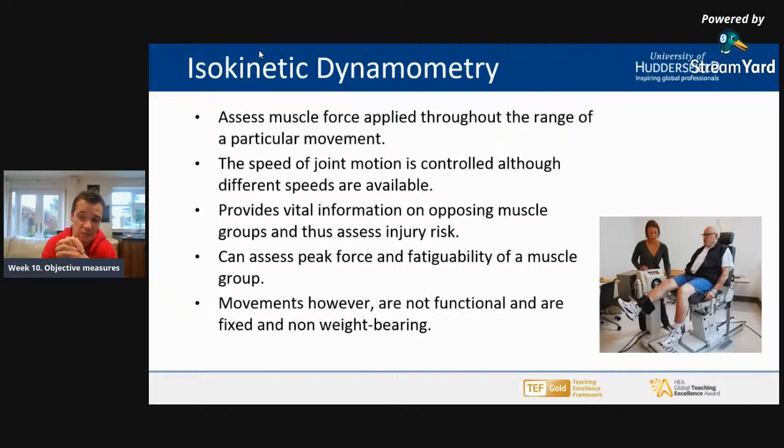that we're set up for knee extension and flexion. So what the isokinetic dynamometer is assessing there is the strength of the quadriceps against the hamstrings. And if you go on to look at this in a bit more detail, or if you go and work in things like elite sport, they're often reported as a ratio.